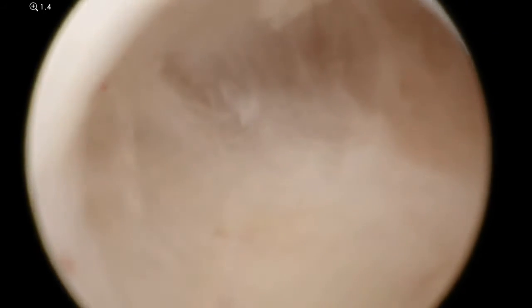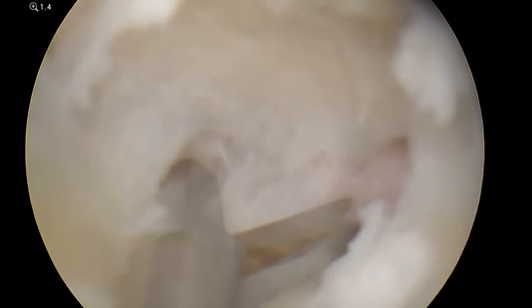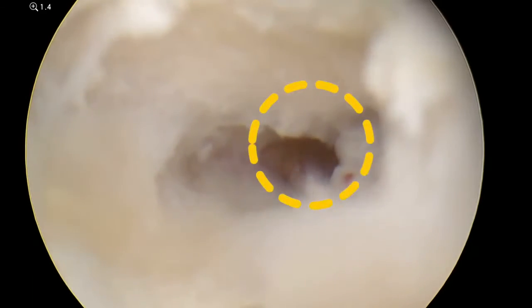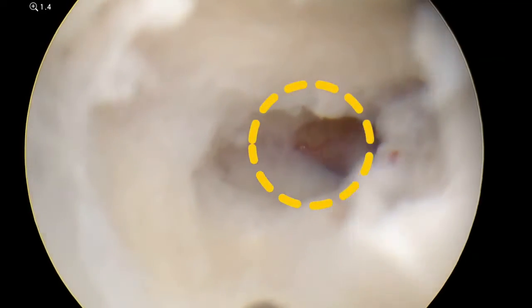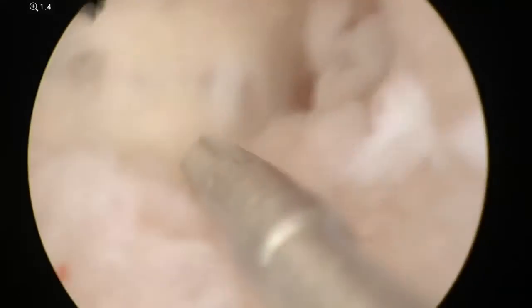Care is taken to minimize axial deviation. In this video from another case, excess deviation to one side results in perforation. Because there was no suspicion of intraperitoneal injury and the site was hemostatic, the hysteroscope was able to be reoriented and the case finished. Dissection is carried cephalad towards the fundus and laterally towards the ostia, and also into the lateral walls of the cavity.